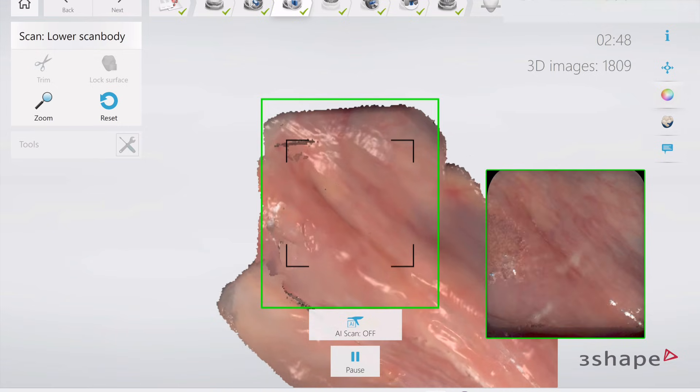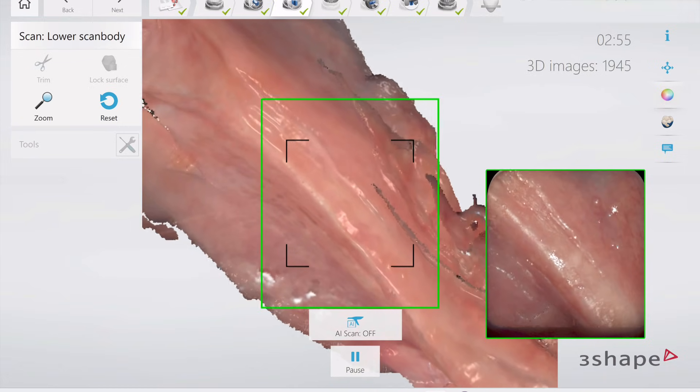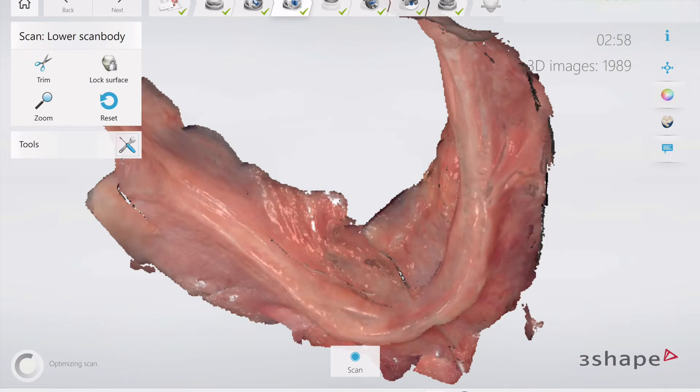And a little bit more critical, because with those scans, all we need is tissue and we're doing photogrammetry to get the implant positions. But with this, we're actually needing to have an accurate scan of the tissues. So we're able to go and recapitulate back down that ridge.